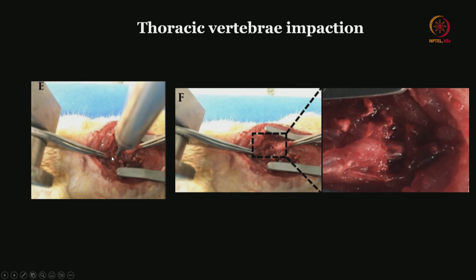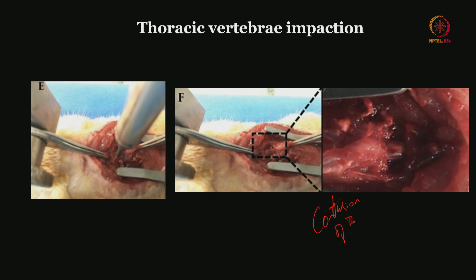In this zoomed-in view, you fixate the spinal process using rigid fixators — a forceps holding the spinous process on both sides. These are the retractor blades holding the skin and muscle tissue, which are self-retaining. The tip of the impactor is closer to the cord after you expose the cord. On the right-hand side you can see the spinal cord exposed with the dura visible. After the impaction by the impactor, the tip has moved and caused an impact — the bluish discoloration is the contusion.